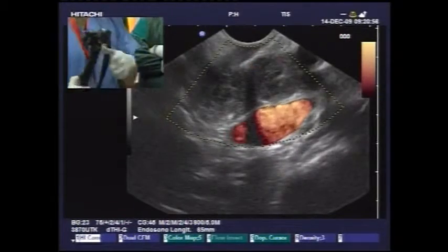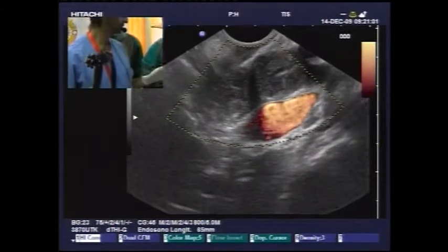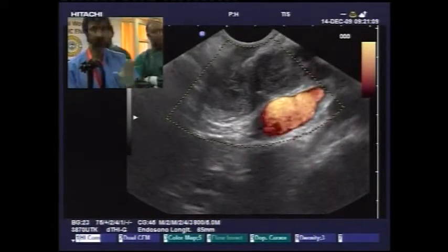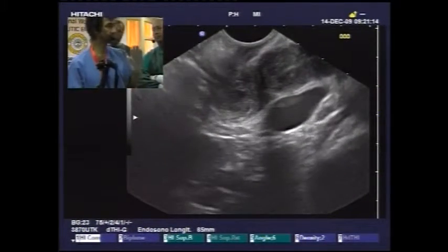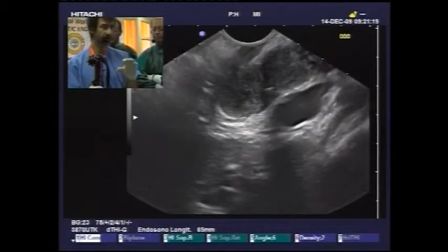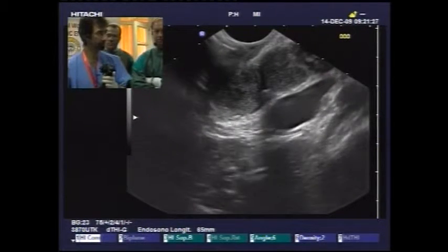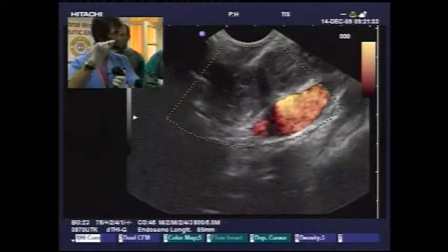I have already asked about HCV infection in this young lady, and they told me that there is no HCV. I agree with you, because sometimes when you have an HCV patient, we have big lymph nodes at the hilum, but usually those lymph nodes have the appearance of inflammatory lymph nodes. So the endosonographic characters are very well defined: it's ovoid, you have a clear hyperechoic central hilum, you have a clear vascular pattern with vessels inside.